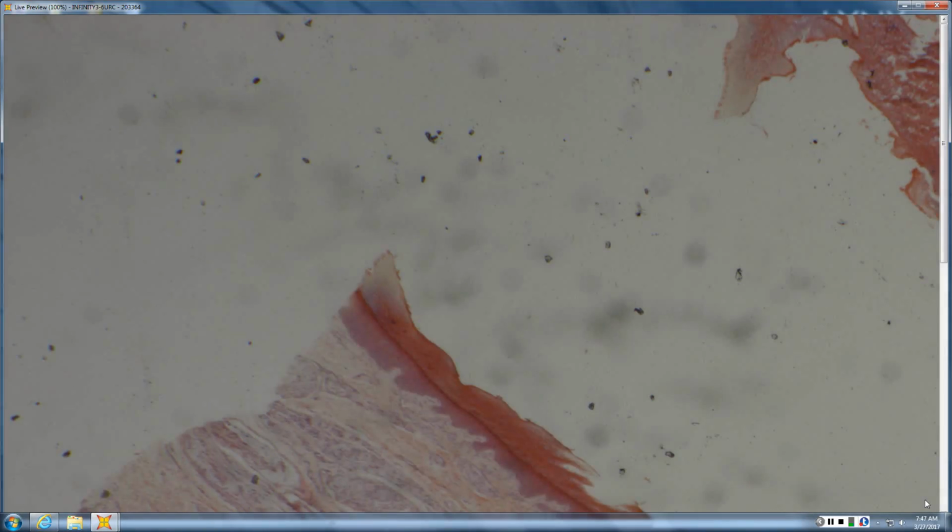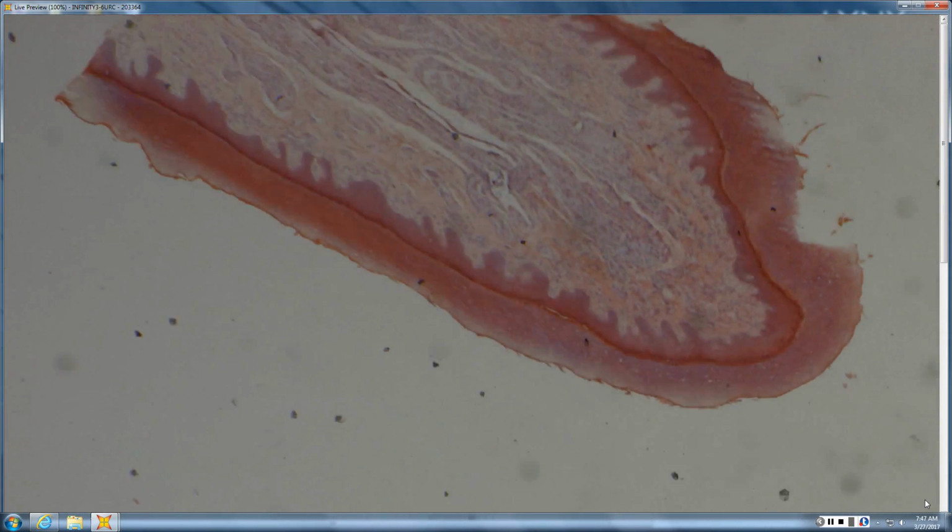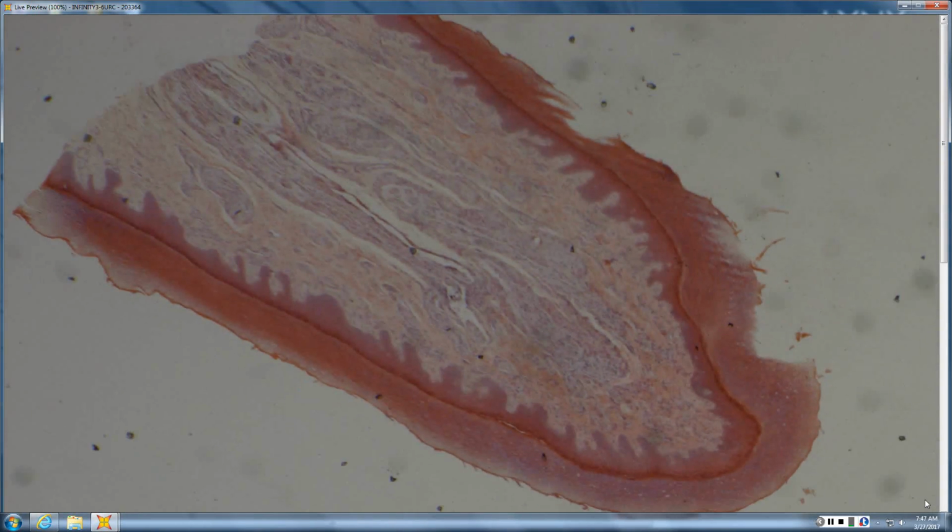Okay, how about this one? Looks like we have some nerve tissue, solitary papule. So I'm thinking like a supernumerary digit. Yeah, and in fact, this one is acral, even shaped like a finger, right? The fingernail should sit right about there, right? So this one even looks like a little finger.